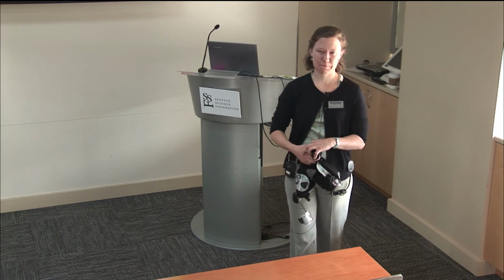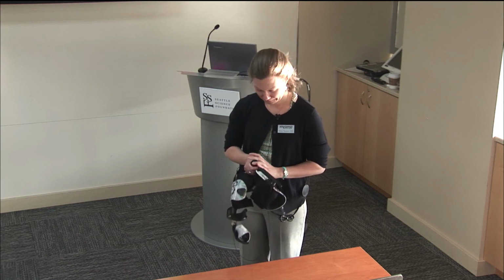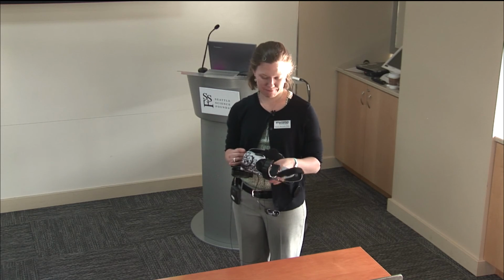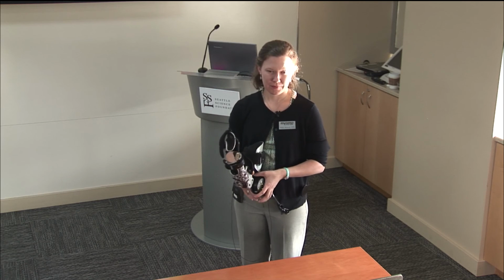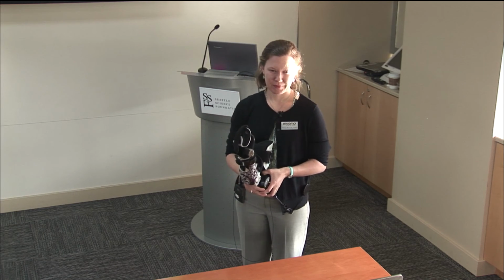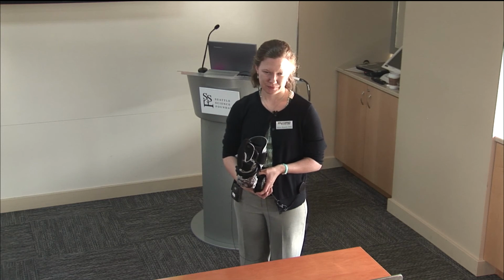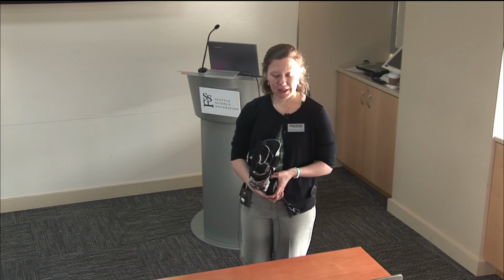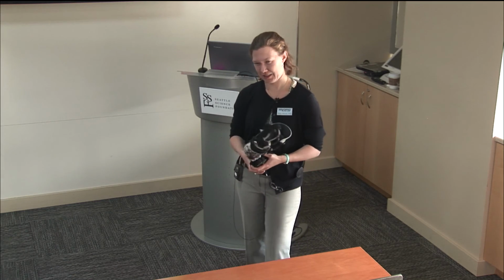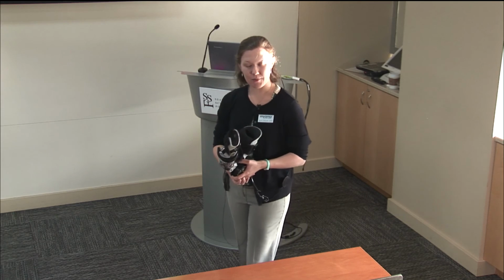You mentioned the wrist device with the ability to flex, extend, radial deviate, ulnar deviate, pronate, supinate. A much more complex set of motions than the simple hinge at the elbow. And I assume requiring 6 sensors for each of the 6 motions. It is, yeah. Correspondingly greater cost. So it is not an EMG-driven wrist.